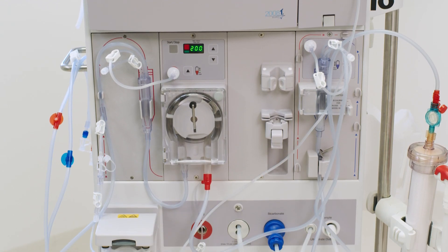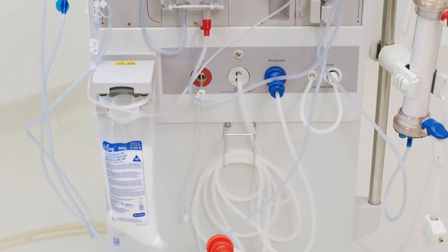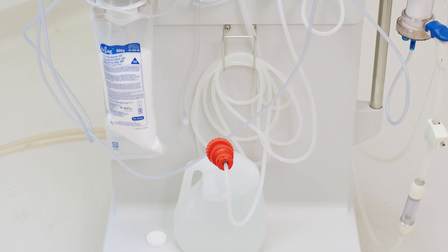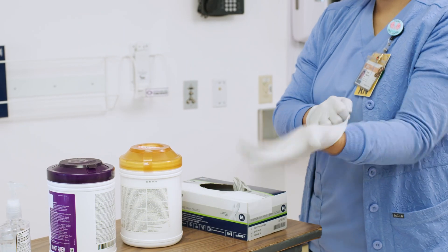Visibly check the machine for any soiling or blood on the surface of the machine or other surfaces within the station. If there is blood or other visible soil, these surfaces must be cleaned before disinfection begins. Doff gloves, perform hand hygiene, and don a new pair of gloves.